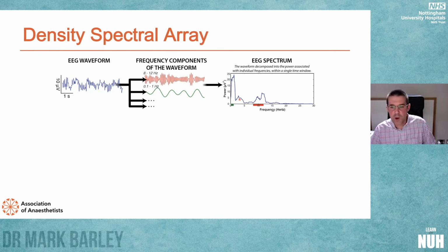Now, these diagrams tend to update on the machines about once every 5 seconds, which means it's not really very useful for assessing what has happened in the past and for getting a feel for the potential direction we're going. So these diagrams, which I think of a bit like those stages in the Tour de France, really, can be stacked up next to each other to give us a chronological recording of what has happened.